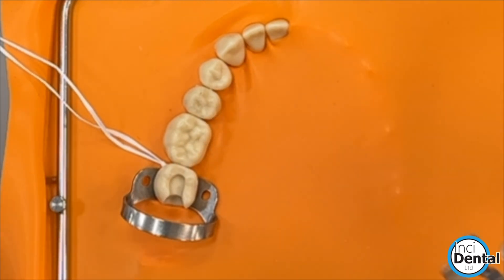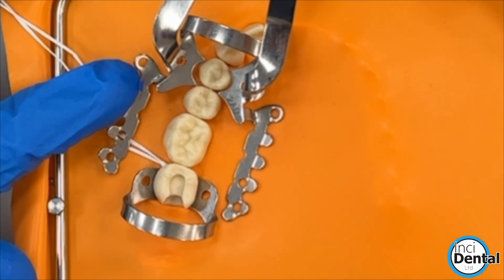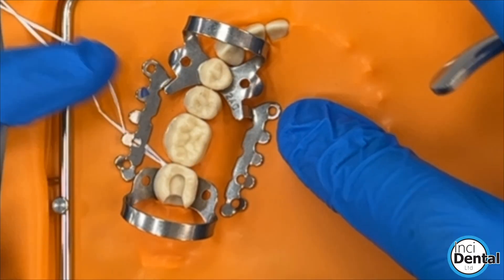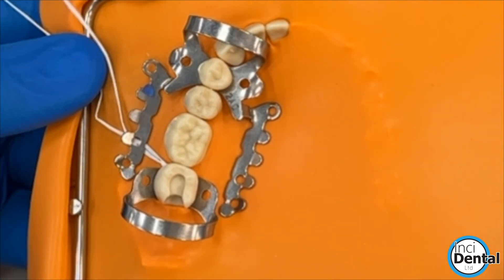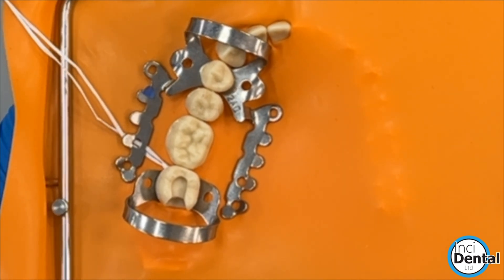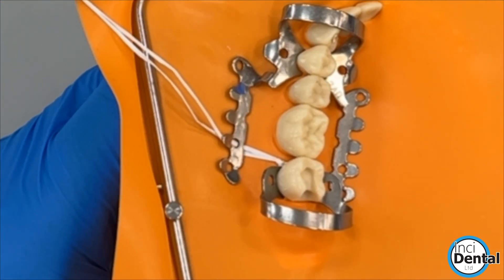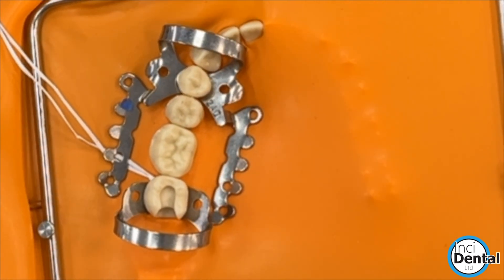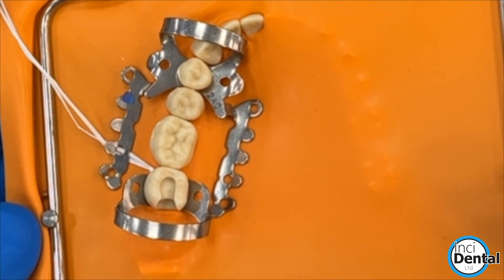It's worth saying that the 2AD clamp is not just good for the last tooth in the arch. It's also just really helpful for providing a huge amount of retraction and it pulls the dam down apically. So this can be helpful when you're doing crown preps, even under split dams, just to pull the tongue out of the way and to give you access, which after all is a big part of what the rubber dam is all about.